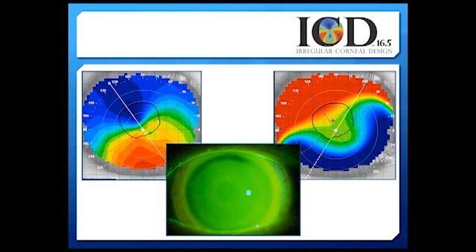And the best way to determine what is the highest point on the eye surface is to use your corneal topographer and pull up the elevation display. The upper right image shows you your elevation map, and red is where the eye surface is high. Blue is where the eye surface is low. So the axial map tells you where the eye is curved, but it doesn't tell you where the eye is curved up as an elevation or down as a depression. This red could be the starting point of a volcano where you're hitting a very high point, or it could be the edge of the cliff as you fall into the valley. So use your elevation map to show you where the eye surface is very high.